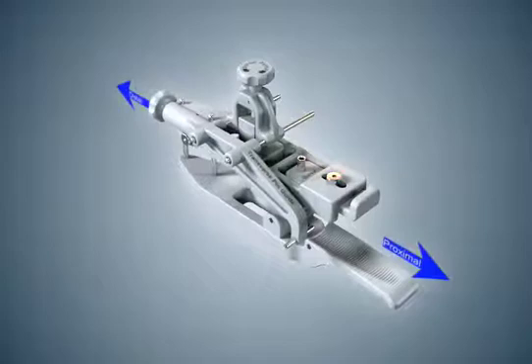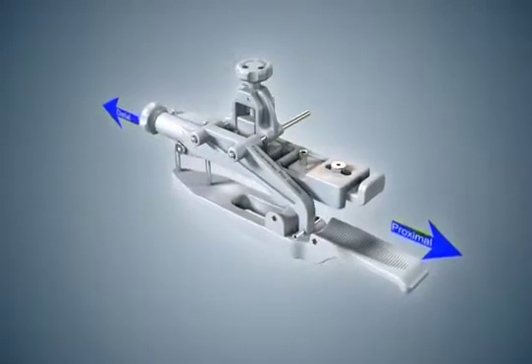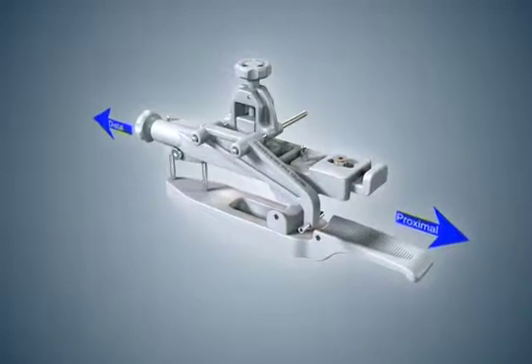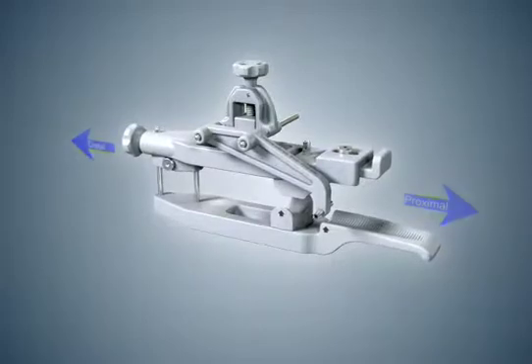Prior to bone pin installation, the middle phalanx must be reduced so placement of the transverse pin does not block joint motion. Proper placement of the pin placement guide on the finger facilitates joint reduction.